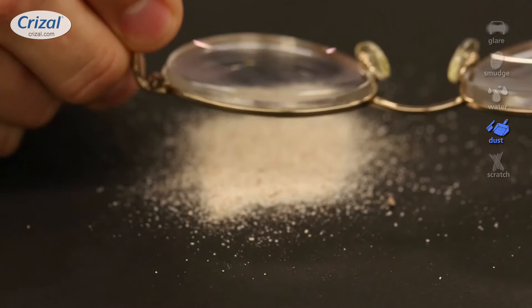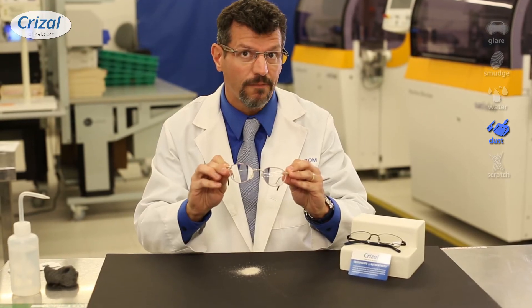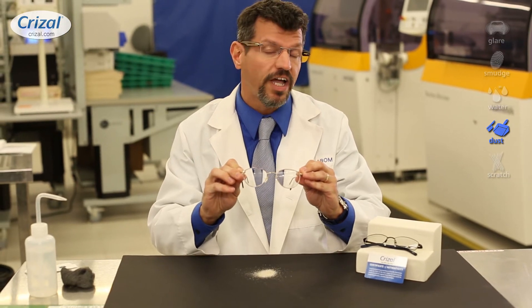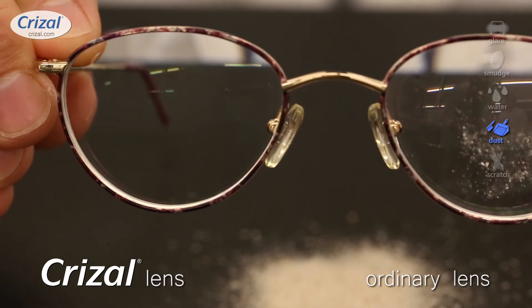On a Chrysal lens, it repels dust because it doesn't build up the static electricity, and you'll see that there's no dust at all. When there's no dust, your eye doesn't focus on the lens itself — it just focuses on what you're trying to see, and you get better vision.